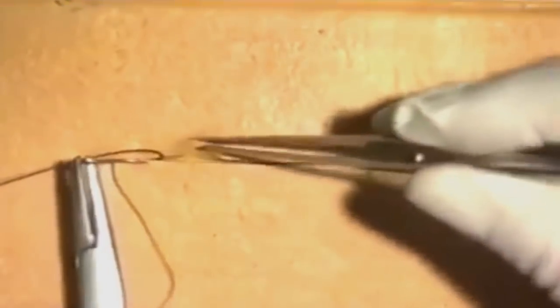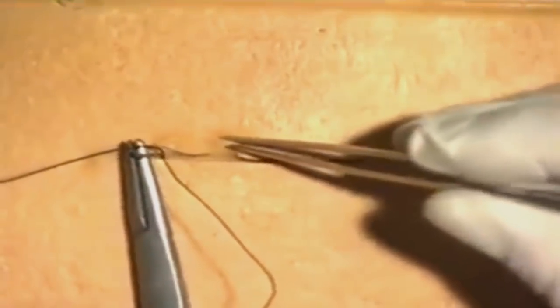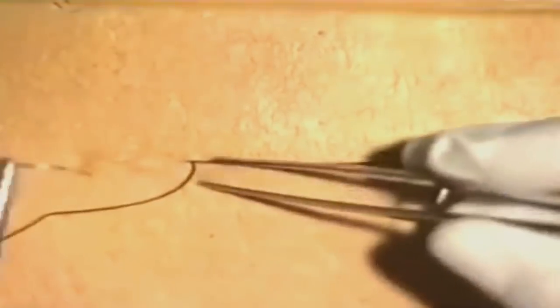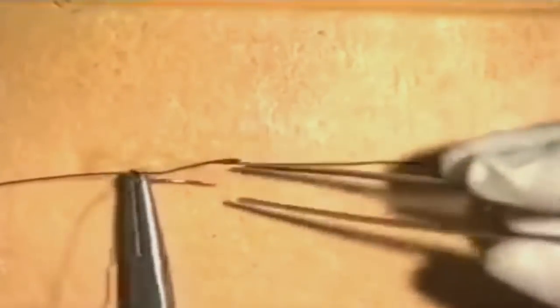Each new suture must be inserted almost opposite the exit of the previous suture, and this ensures that as the suture material is tightened it draws the wound edges together almost in the manner of invisible mending. The accuracy of the placement of the sutures will ensure an equal tension down the wound and neatness of the closure.